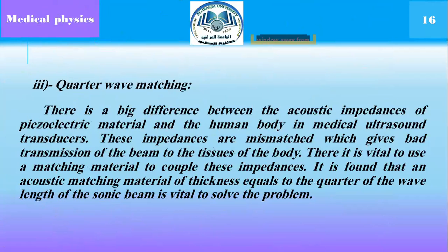Third, quarter wave matching. There is a big difference between the acoustic impedance of the piezoelectric material and the human body in a medical ultrasound transducer. The impedances are mismatched, which gives bad transmission of the beam to the tissue of the body. Therefore, it's vital to use matching material to couple this impedance.